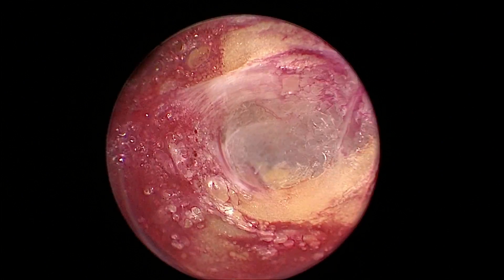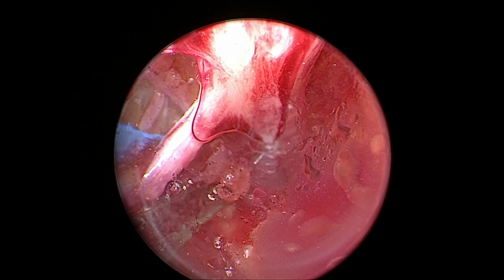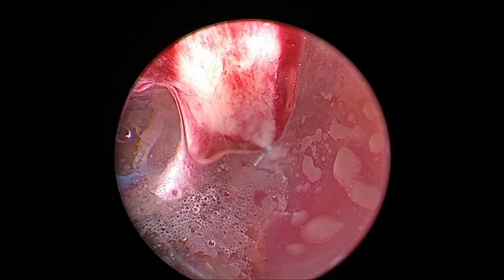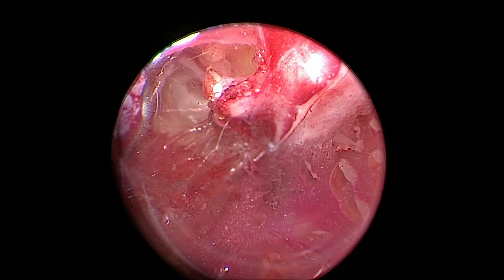You can push through that adventitia. Here's another branch taken by a new user — she made a tiny window and is very good about not doing over-dissection. She cauterizes until she doesn't see any more spray, advances forward just a little bit, does a pullback, and that branch is cut.